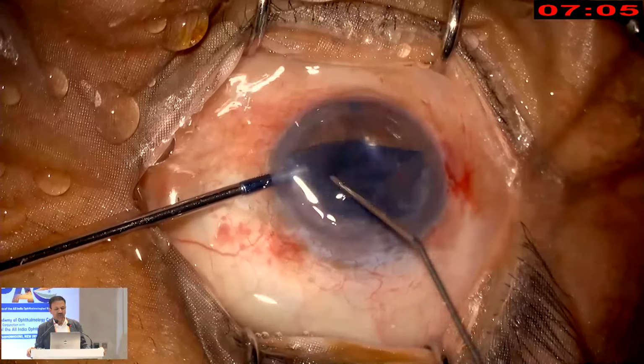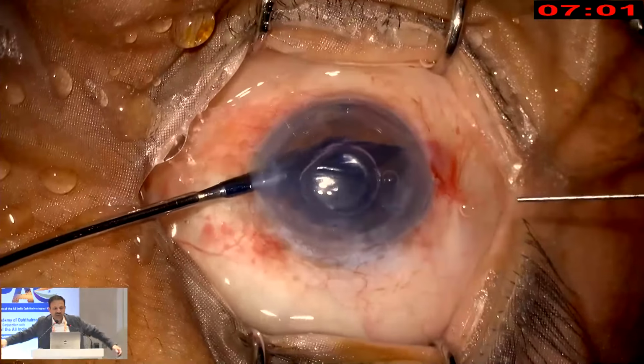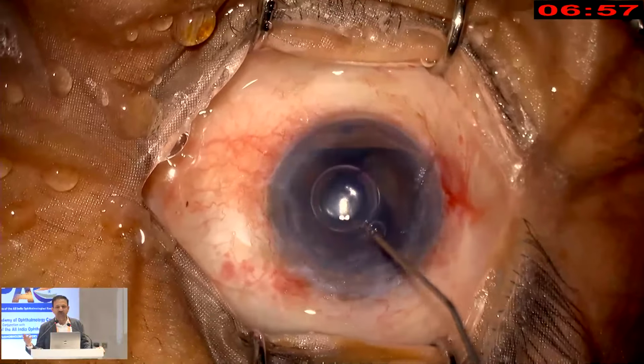And then you can tap on the surface and the scroll. Now the scroll is like that, and you're opening up the scroll, and then you put an air bubble in between the scroll, and you can get the scroll to open up and put an air bubble.